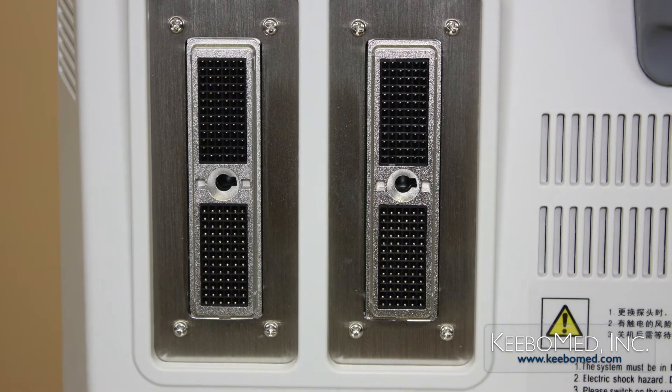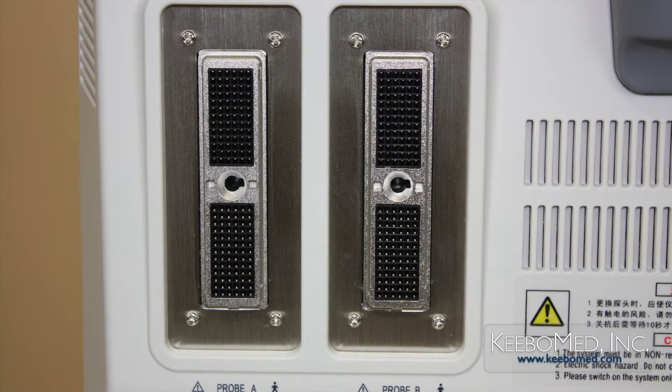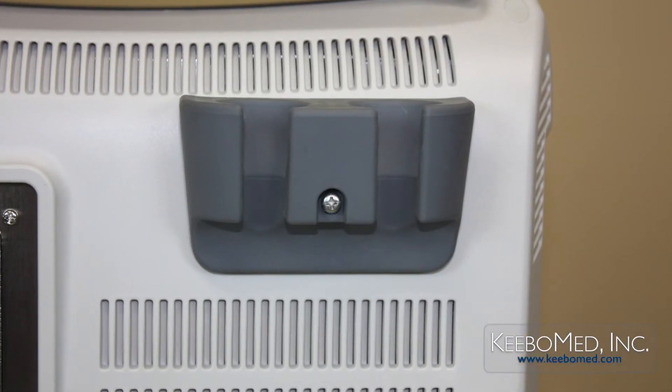Above these ports, there are two probe connector ports, and to the right, there are two probe holders.